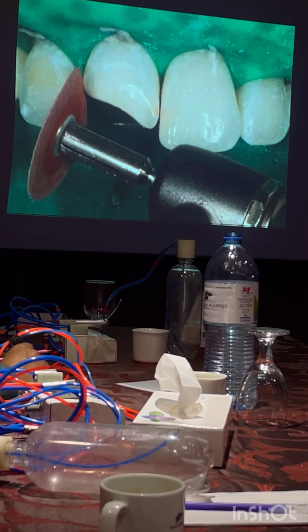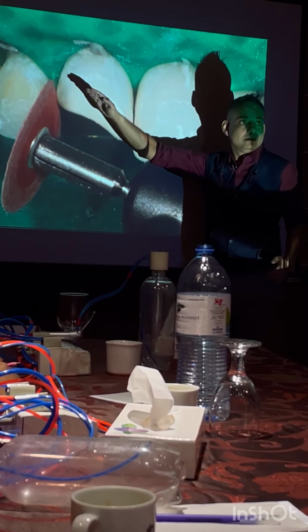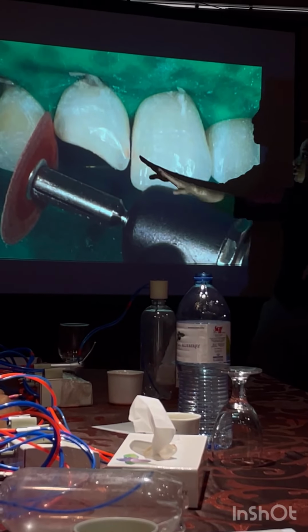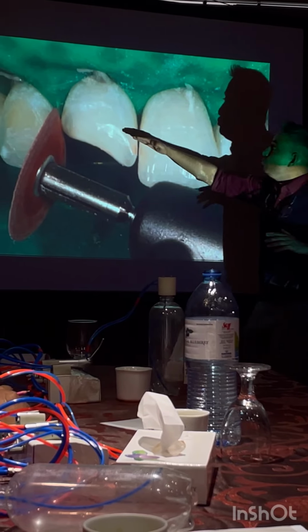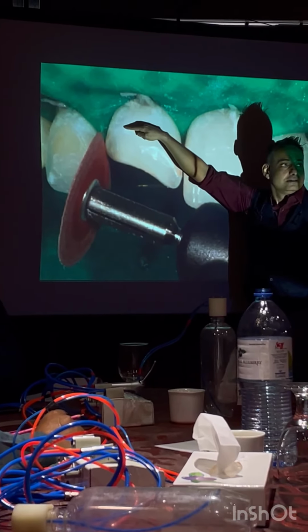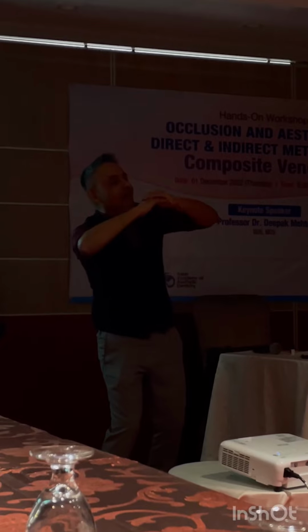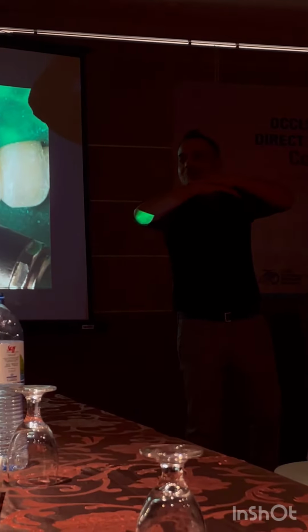You don't stop here. There is a third trick. What is the third trick? After I give my bevels, what I will do? I will etch. Correct? I will etch. Most of them usually etch only till the bevel. That is wrong. All sides. You will go 2 millimeters beyond the bevel. I will etch till here. So now what happens is my enamel composite will overlap the bevel and it will meet in a seamless margin. So now nobody in this world can make out your line.